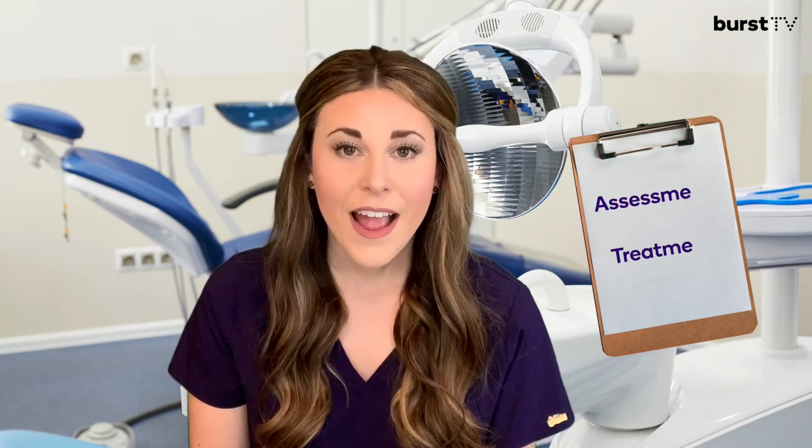Before we go any further, it's important to note that dental and dental hygiene instruments can be broken into two main categories: assessment instruments and treatment instruments.